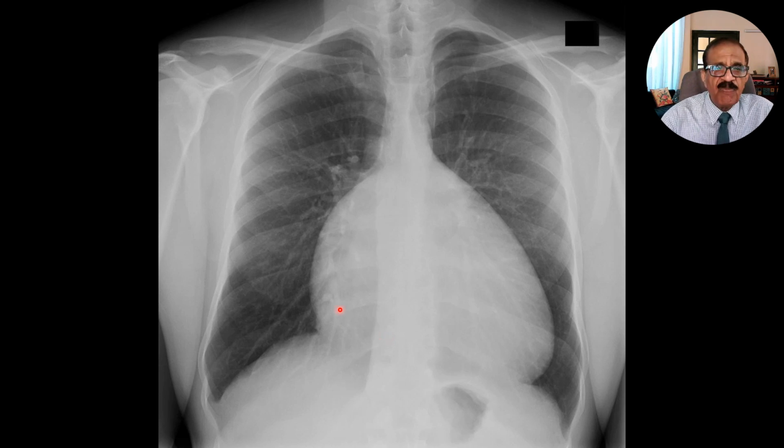You need to have a fairly large amount of pericardial effusion to have this kind of X-ray. I think very, very typical. Lung fields are very clear, because in pericardial effusion, you don't have pulmonary edema. Mostly you don't get pulmonary edema in pericardial effusion, because the right ventricle is also not receiving blood because of the increased pressure in the pericardium. Right ventricle is not receiving blood, and it is not pumping into the lungs.